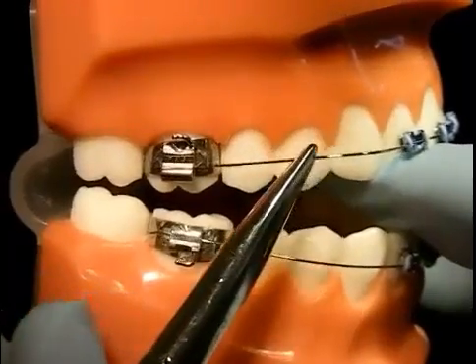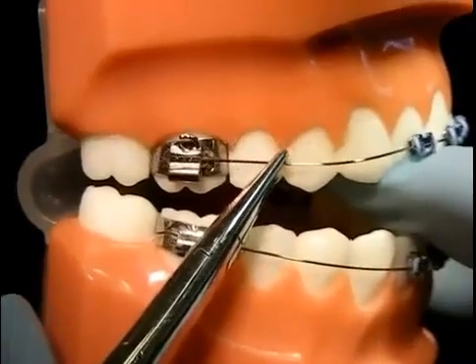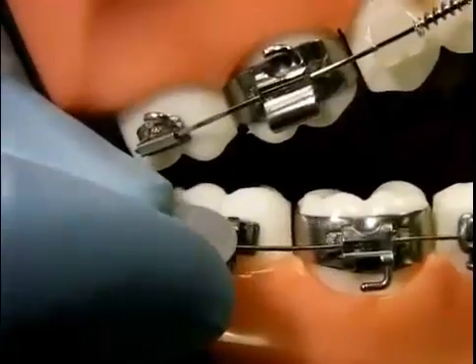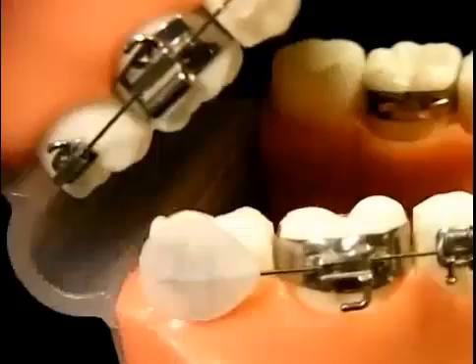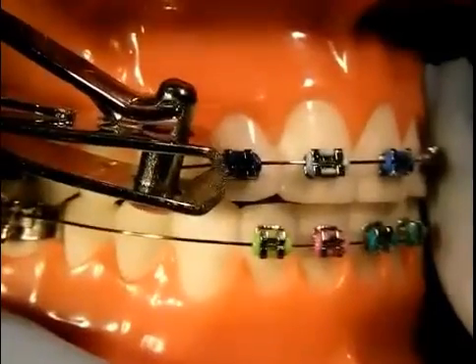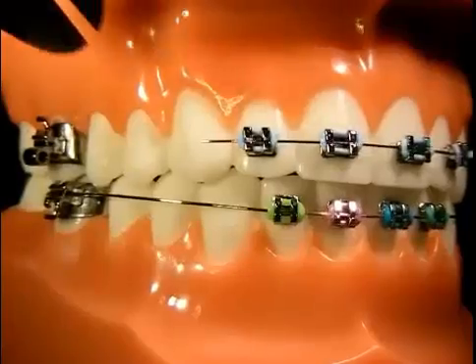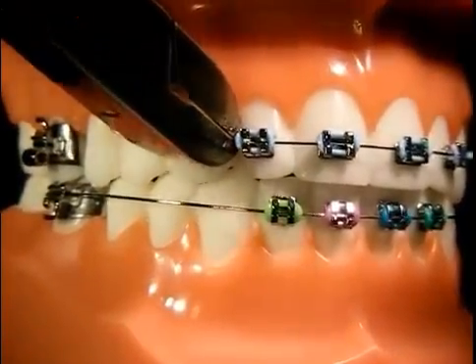When this happens, you can try carefully reinserting the wire into the tube using a pair of tweezers. If this is not possible, you can use a piece of wax to hold the arch wire in place. As a last resort, you can try to cut the wire next to the closest bracket with a pair of nail clippers or a small wire cutter that has been cleaned with alcohol. Be sure to consult your orthodontist before you attempt this.